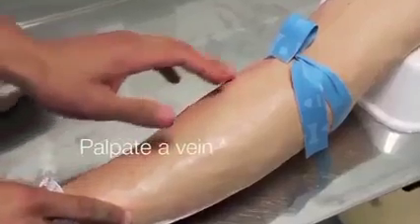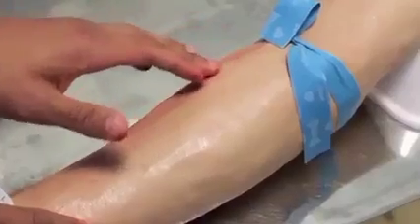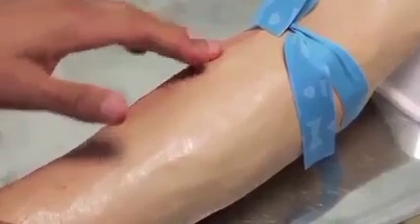When looking for a vein, it's better to have one that you can feel rather than see. Look for the direction of the vein. Once you've found a suitable one that seems straight and big enough to go into, get the rest of your equipment ready.